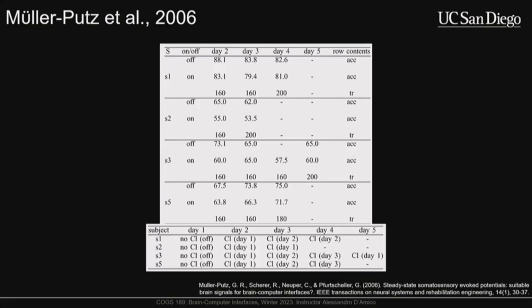But it's also more pragmatic because you wouldn't necessarily want to have to collect calibration data the first time a participant wakes up every day, or maybe 4 times a day, in order to get a system to work. So if you can make a system that can work on the previous day's recordings, then it'll end up being more usable over time. And then they also looked at the offline, where I think they changed the parameters in terms of the sliding windows they had access to, and then their actual online, which was calibrated on the previous data and was actually working in real time.